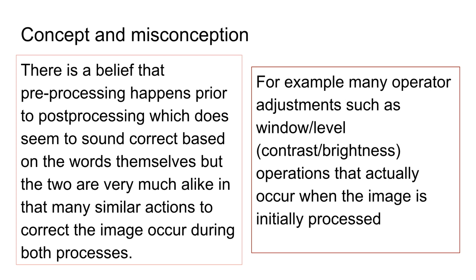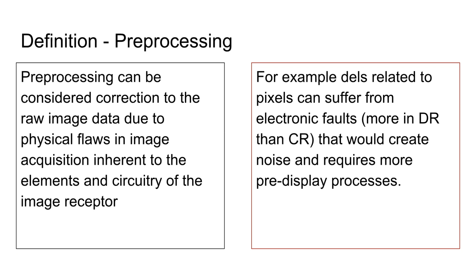And if we decide to change the image, change the brightness, change the contrast, crop the image, that's even worse, then you may be taking away or limiting the radiologist. They may not be able to uncrop. It might just be gone. They may be limited in their ability to window the contrast or change the level of brightness. Right.